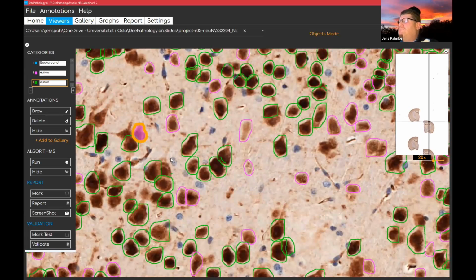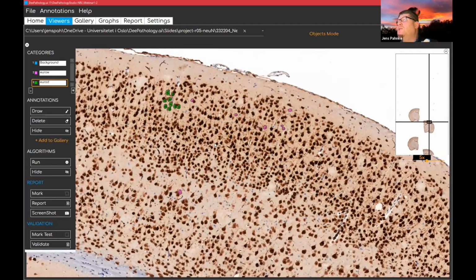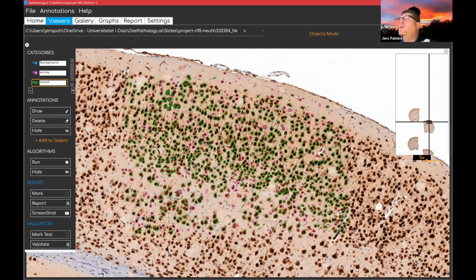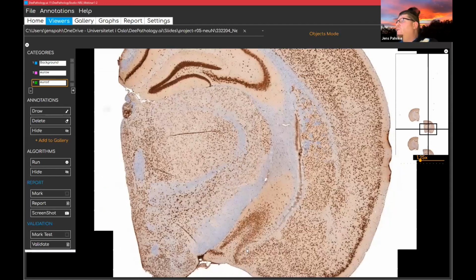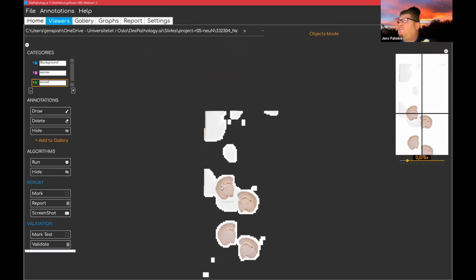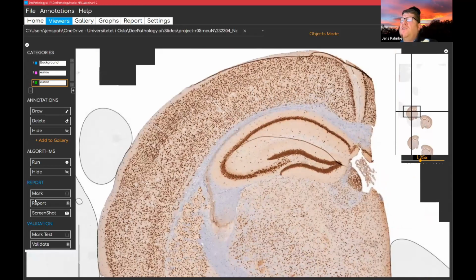And here go a little bit more down here. So I think this example is finished. So you can use this now. And if you want, let's have a look at the graph here. It's now 12 epochs. You could stop the learning, but you could also now do the following. You take your new slide, you take another slide, take this one here, for example. Now we choose the location of interest. We mark our, I'm interested in this part here.